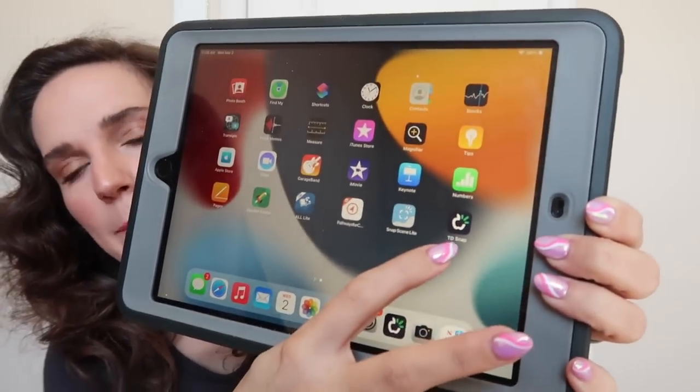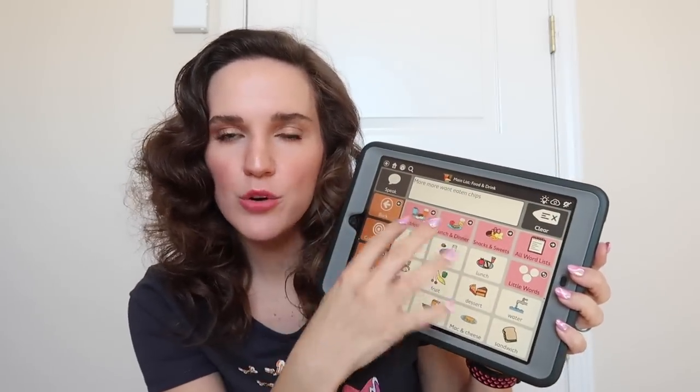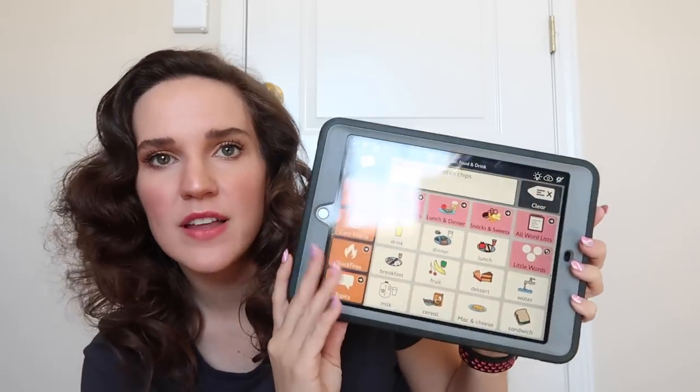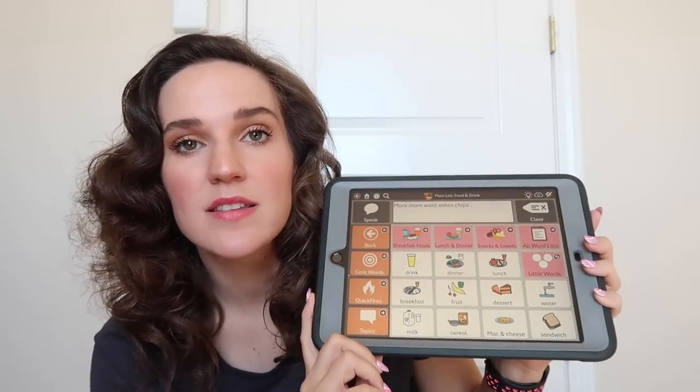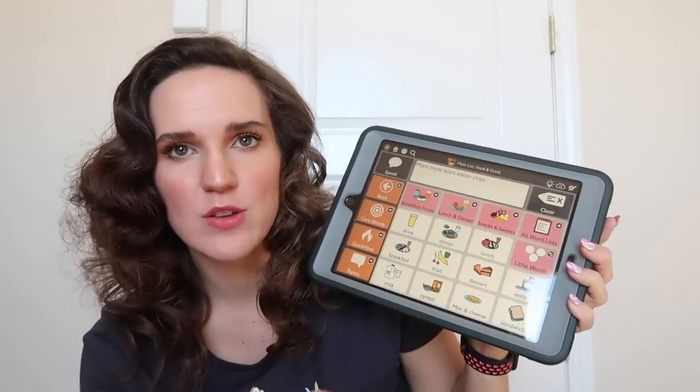Here is her communication device. We use the Tobii Dynavox app. Let me show you what the app looks like — it looks like a little apple icon and then you open it up. There are a bunch of different grids you can get — really small grids or a lot of them. We're in like the medium one. This is the same app as Griffin's, our son who has Angelman syndrome. He has a communication device and it looks very similar. It's the same app and the same grid.